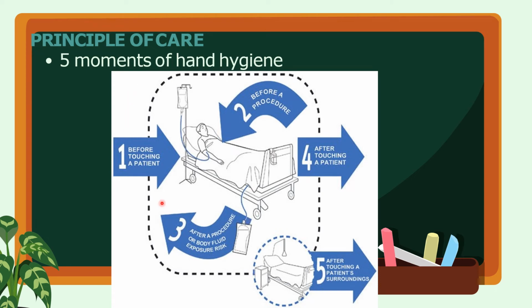So these are the 5 moments of hand hygiene. You must perform hand washing before touching a patient, before doing a procedure, after performing a procedure or body fluid exposure risk, after touching a patient, and lastly, after touching a patient's surroundings.